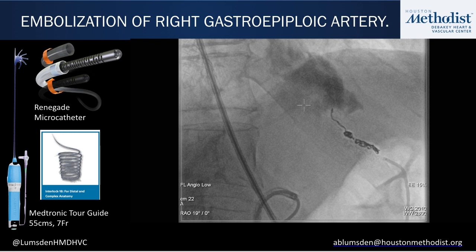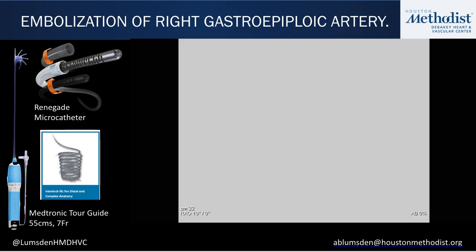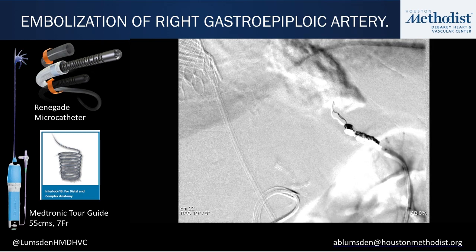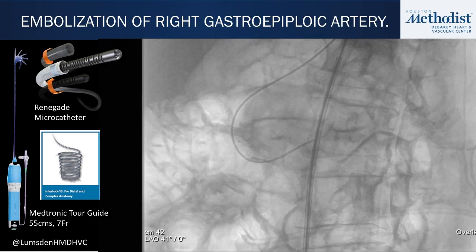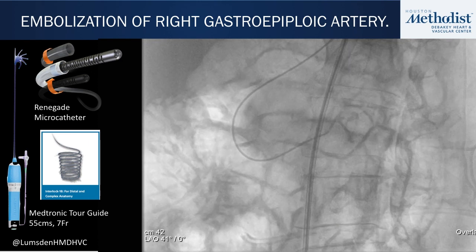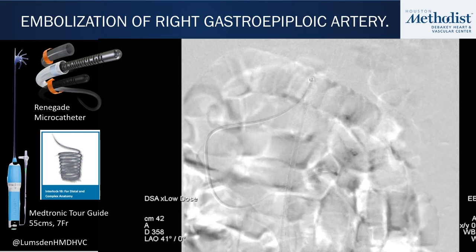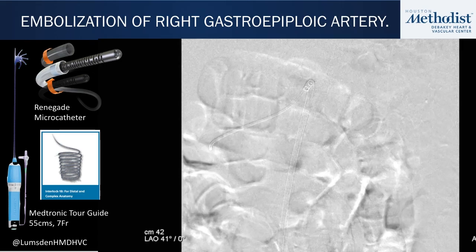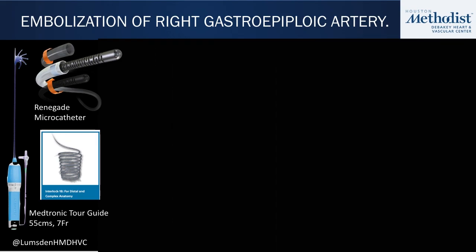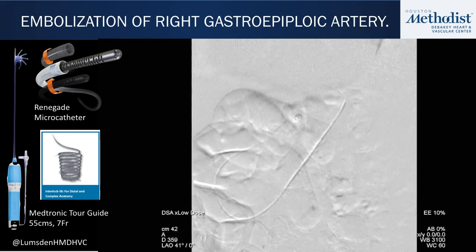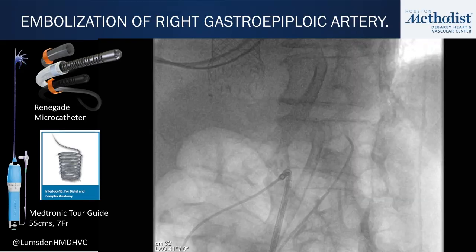In this situation, an educated guess worked. We used a combination of the Tourguide catheter, Interlock-18 coils, and the Renegade microcatheter. You can see the artery is occluded when we inject contrast. To run through this one more time: we tracked the artery from the celiac, advanced up the gastroepiploic, and then went ahead and embolized it.